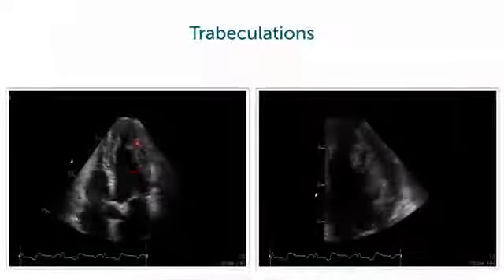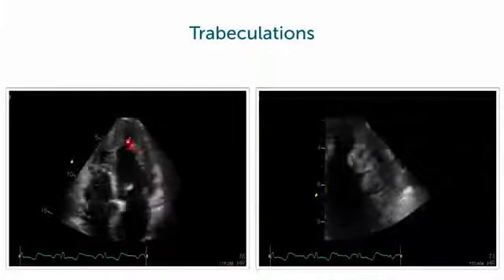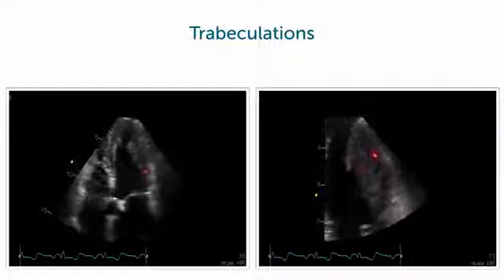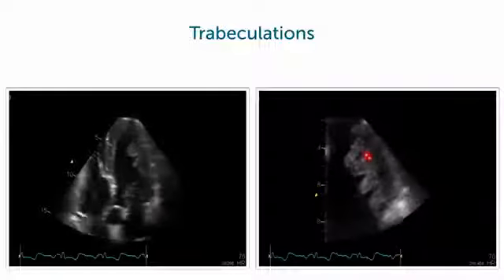And this is one of the major differential diagnoses that we have to make in such a situation. Here an example where, to be honest, I don't know what the true answer is. You see very prominent trabecula here. Is this just a prominent trabeculation, or is it already some form of non-compaction? In any case, this is not a tumor. This is myocardium. And if you're not sure, inject contrast. That can give you additional information whether it is a tumor or myocardium.